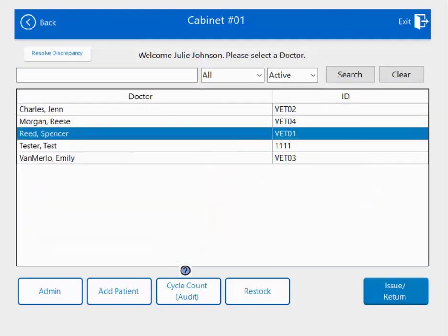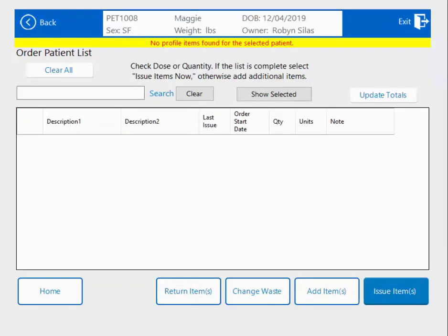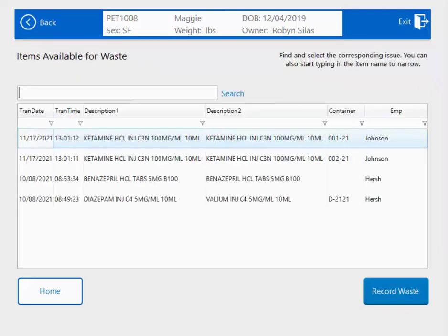Hit Next, select your doctor, hit Issue Return, and now instead of Add Items, I'm going to change to Waste. What Cubex is going to do is bring up everything that's been issued out to this patient.